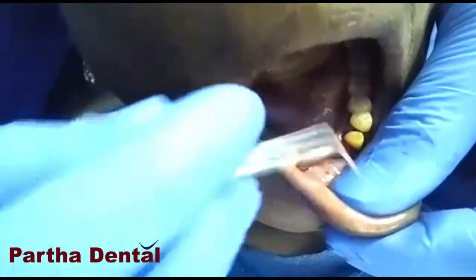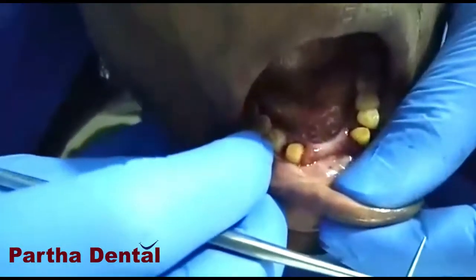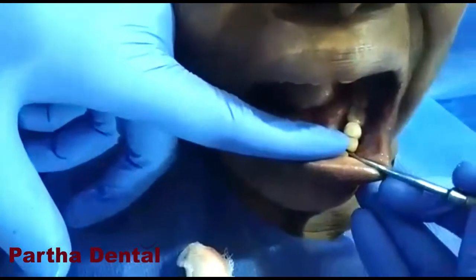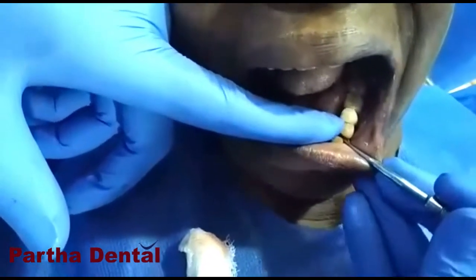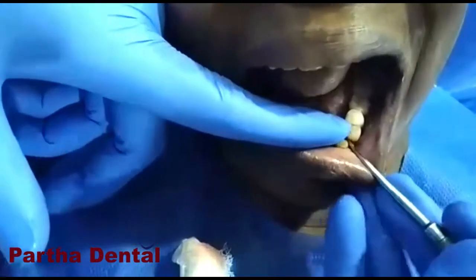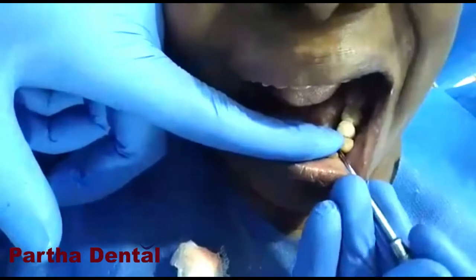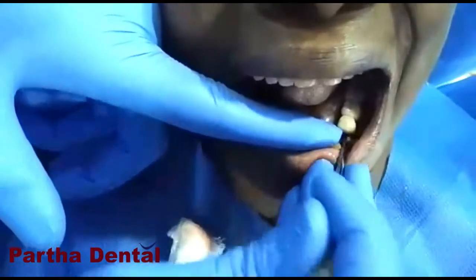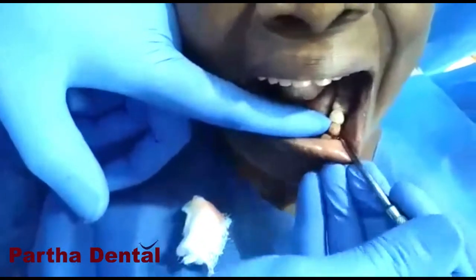So let us start the implantation procedure and I will show you how we will do it. So we are extracting the tooth — it's very simple as it is grade 2 mobility.